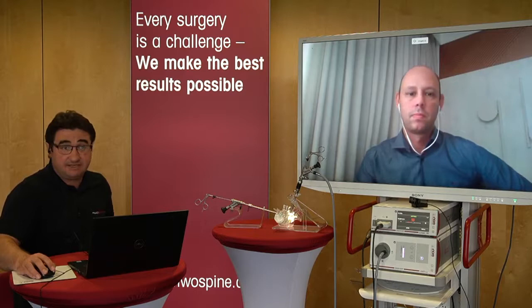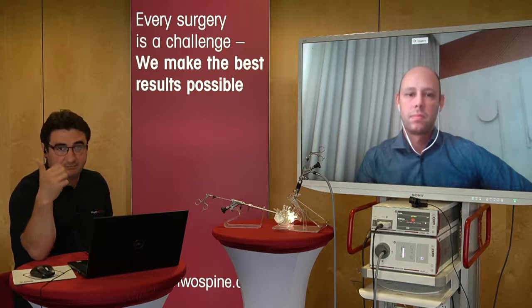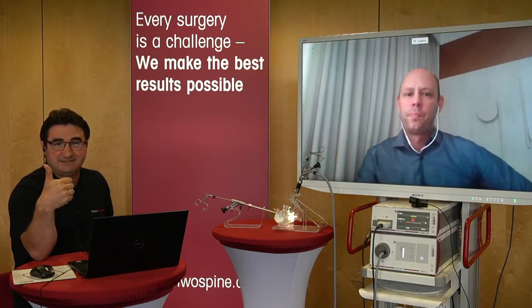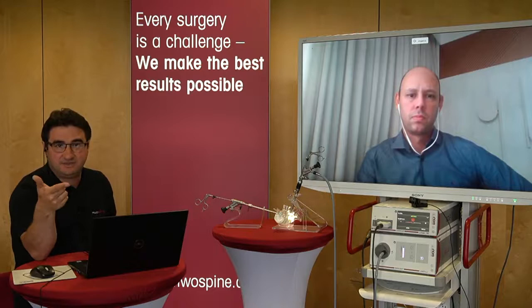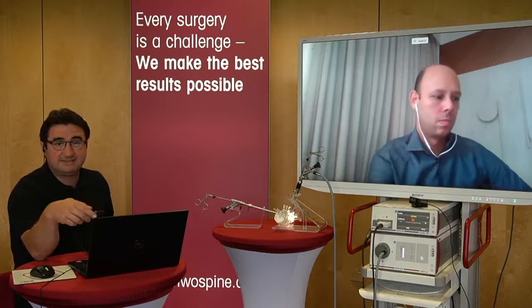For my side, if it is possible, it's better to do it transforaminally because it is a less invasive technique when you compare it with the interlaminar approach, because you use the open gate to the spinal canal. But we have some restrictions for the transforaminal approach. Basically, of course, you can increase your indications. If the foramen is closed by the iliac crest from the lateral side, then we switch to interlaminar approach. And if the disc herniation migrated cranially or caudally according to the disc level, again, it's better to do it with an interlaminar approach.